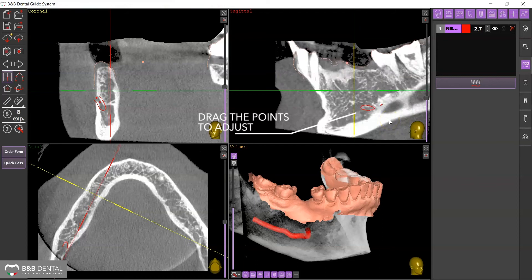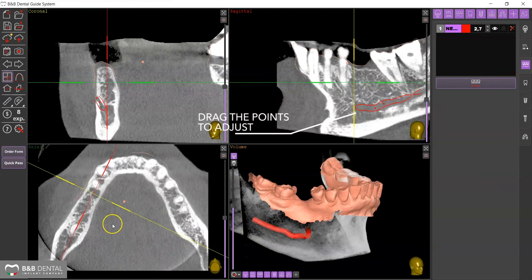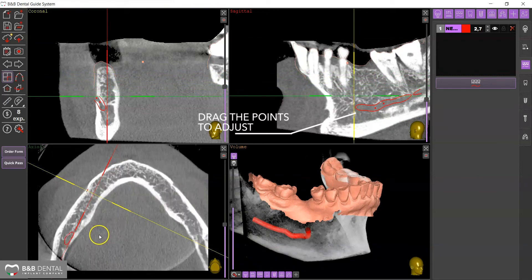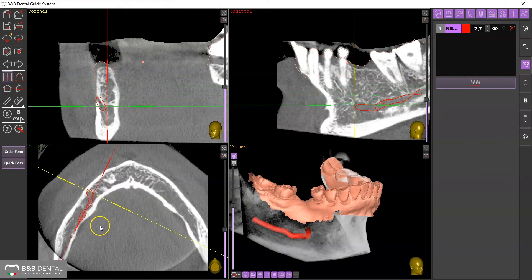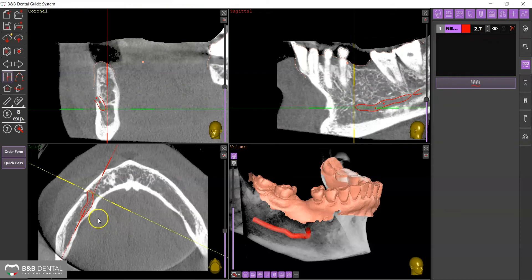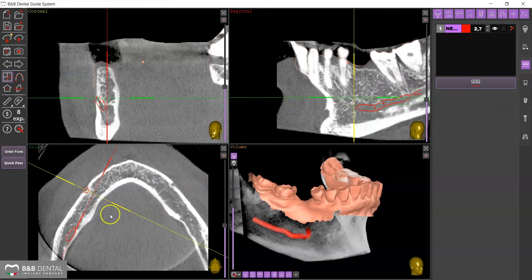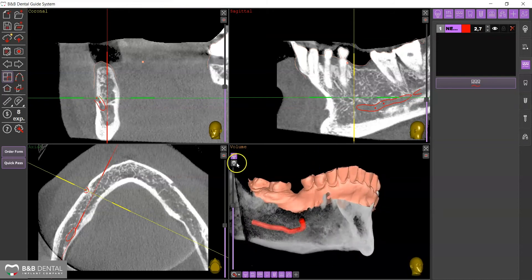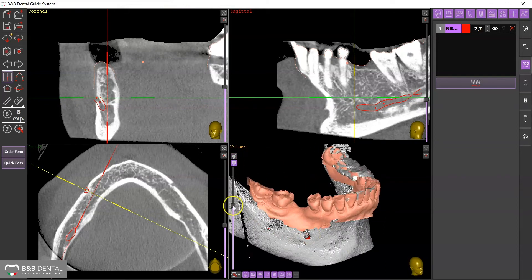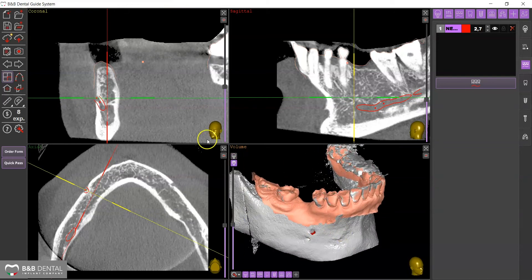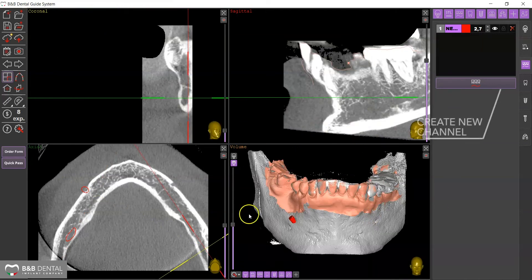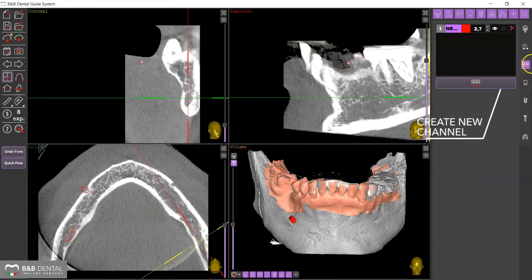You can adjust the position by moving the points on any display to improve its precision. Proceed in the same manner to draw the opposite canal.